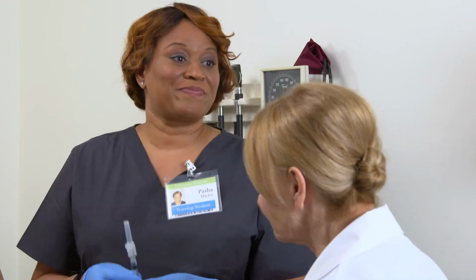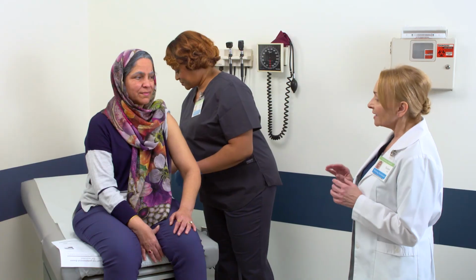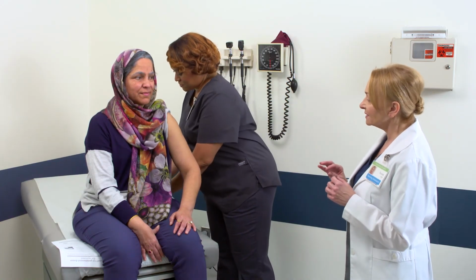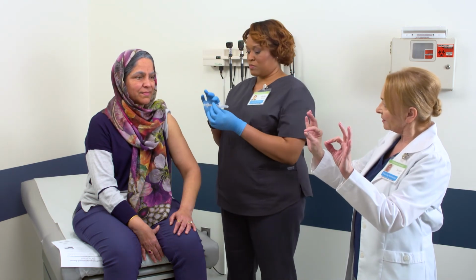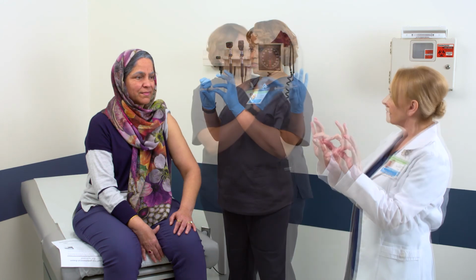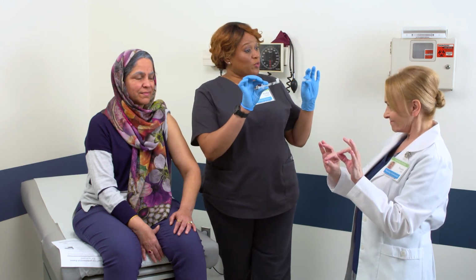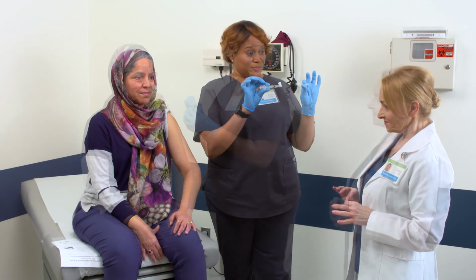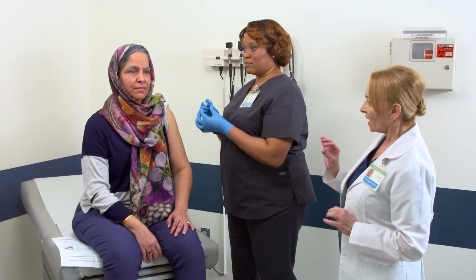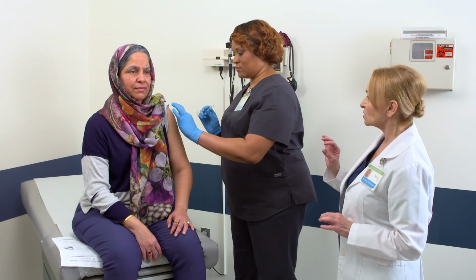Okay, looks good. All set, 0.5 milliliters. And I'll get the gauze pad ready where I can easily reach it. Good. Go ahead and uncap the needle with your hands in the double OK position. Got it. To avoid an accidental needle stick, I take the top straight off like so. Right. Now hold the skin taut and administer using the dart motion we reviewed.